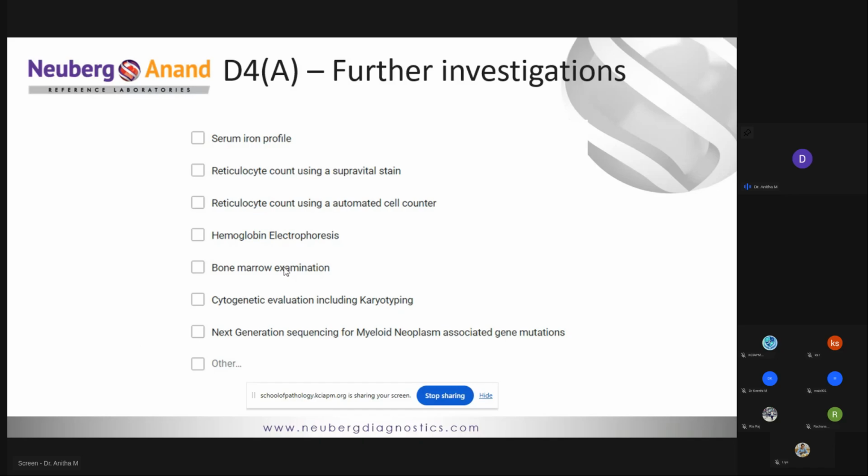So that's one thing which we wanted to emphasize, because everyone had put it as direct Coombs test, indirect Coombs test, but no, we are speaking about a microcytic hypochromic anemia, and there your room to request for a Coombs is absolutely the last test you want to request.